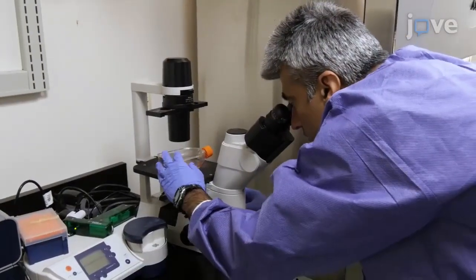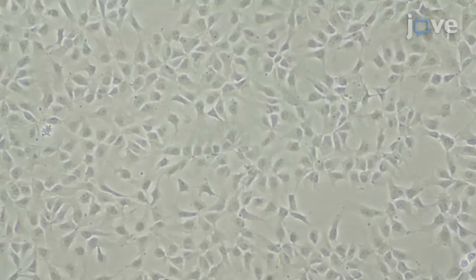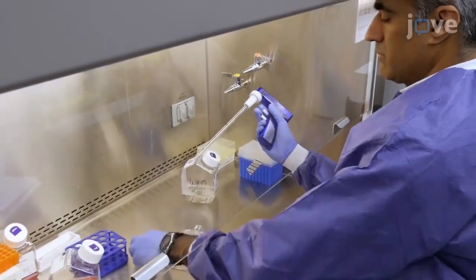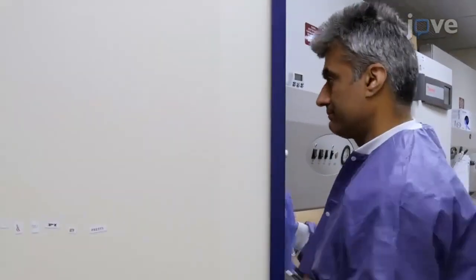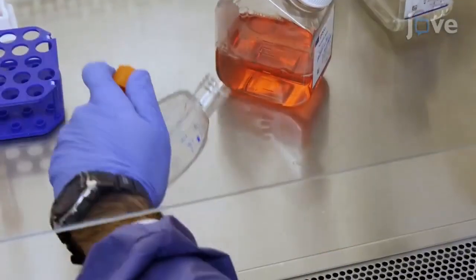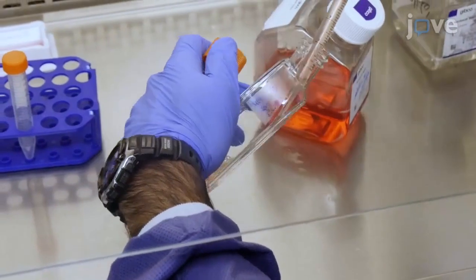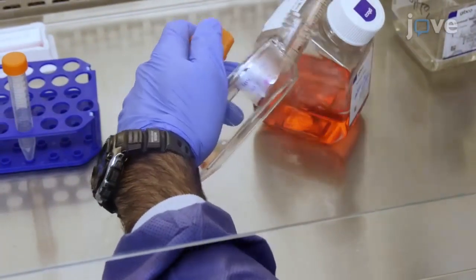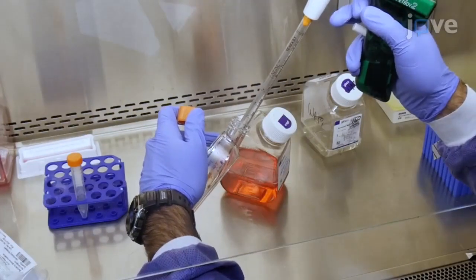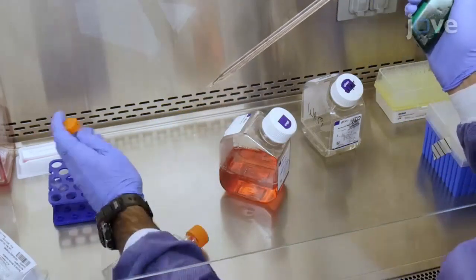Once the cells reach 80% confluence, remove the flask from the incubator and aspirate off NSC medium. Add 3 milliliters of cell dissociation reagent and incubate for 5 minutes in the incubator. After incubation, add 7 milliliters of NSC medium in the flask and pipette vigorously to ensure all cells become detached. Transfer the dissociated cell solution to a 15 milliliter tube and centrifuge at 200 times G for 5 minutes.